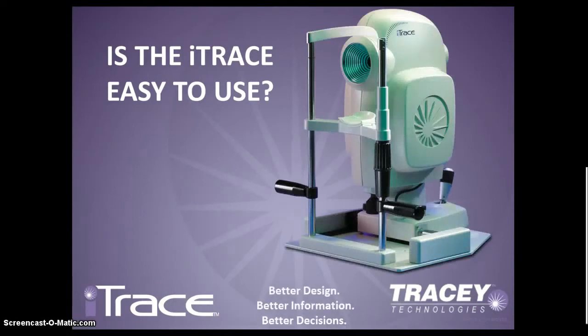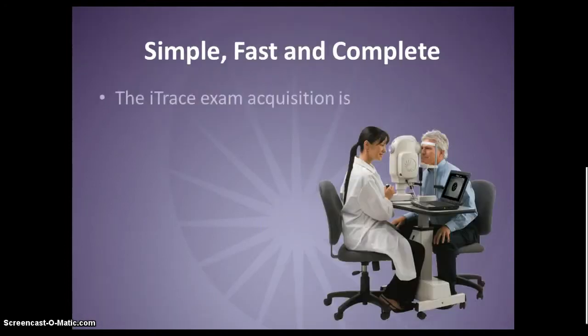In this webcast, we demonstrate how easy it is for you and your technicians to use the iTrace to capture and analyze your patient's wavefront, corneal topography, refraction, and much, much more.